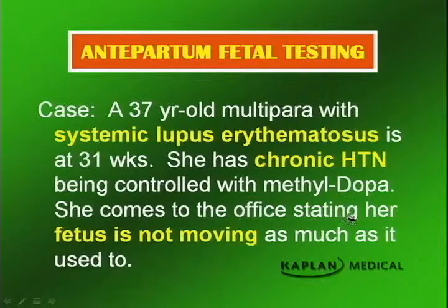She comes to the office stating her fetus is not moving as much as it used to. Decreased fetal movement. That's probably the most common indication for antepartum fetal testing. Let's look at where we're going here.